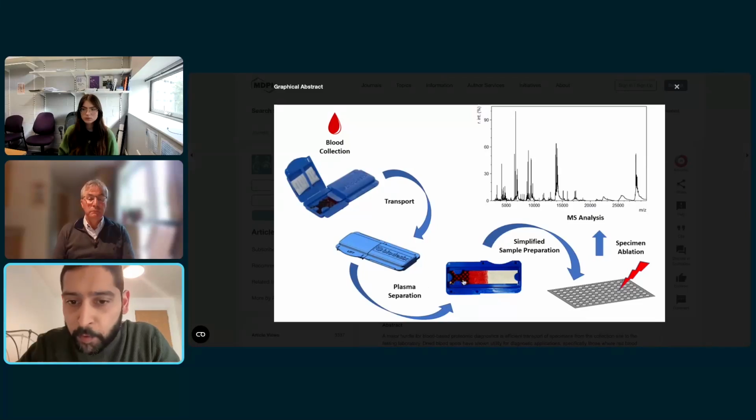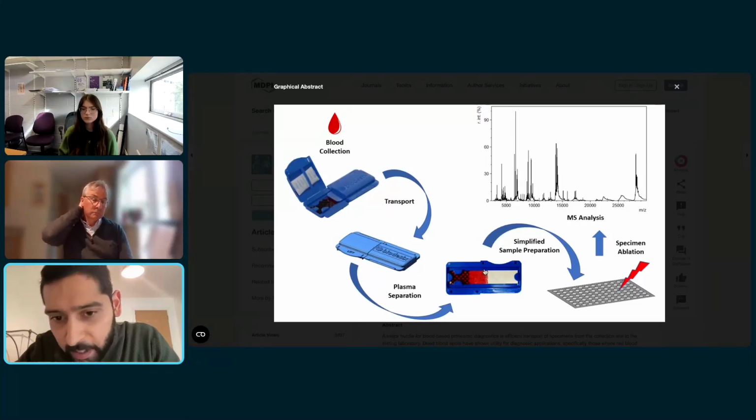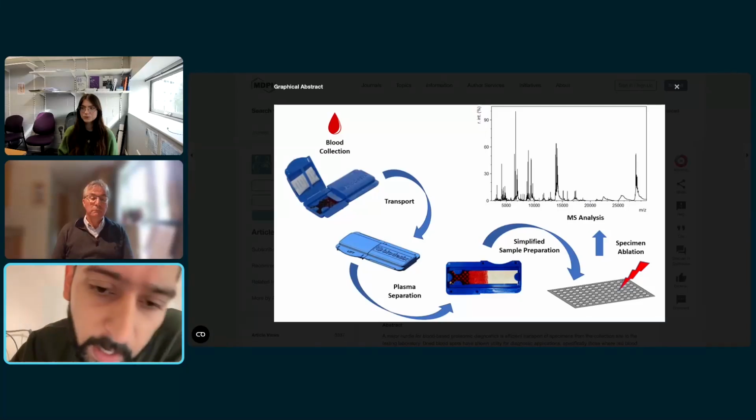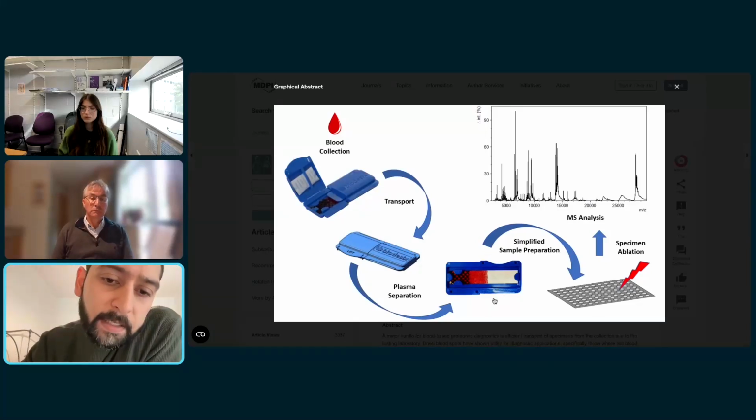Thereby, we hope that this process of lateral flow works fine. But if it's not homogeneously distributed, there may be more red blood cells on one side versus the other. The mesh is supposed to prevent that from happening. And thereafter, once we've got this cellular, non-cellular separation, we cut up our sample. We didn't use typical punch holes that have been used in previous uses of dried spot tests. But what we did was we standardized our method of cutting up this paper, reconstituting with 500 microliters of PBS and spinning it down. And then what we were left with at the end was a sample.